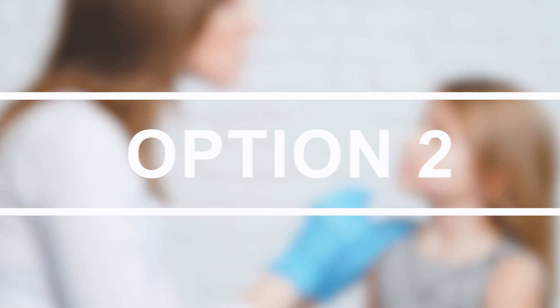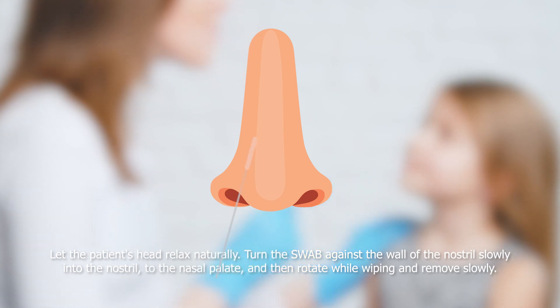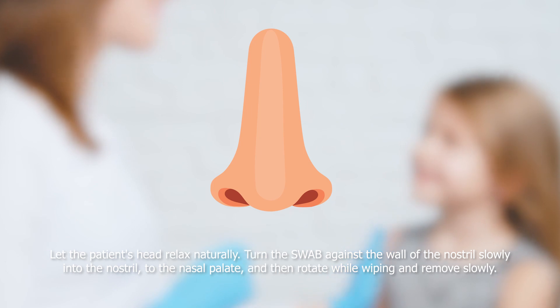Option 2. Let the patient's head relax naturally. Turn the swab against the wall of the nostril and slowly insert into the nostril to the nasal palate, then rotate while wiping and remove slowly.